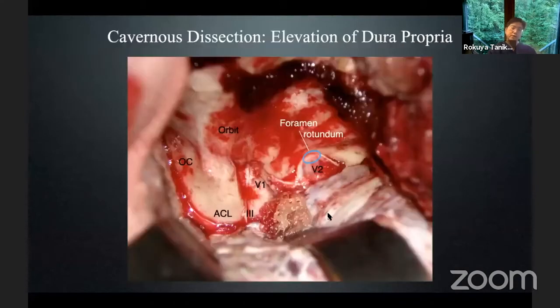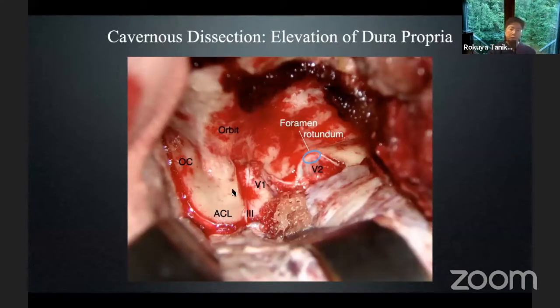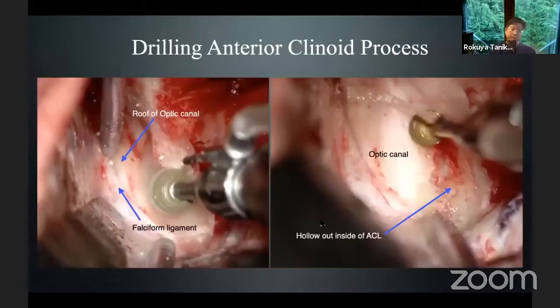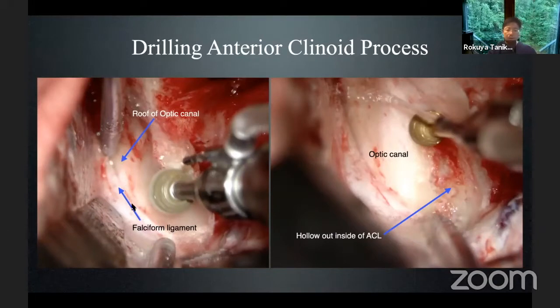This is the actual intraoperative view after elevating dura propria from the superior orbital fissure, exposing the anterior clinoid process lateral edge, V1 and V2, foramen rotundum right here, and the oculomotor nerve should be here. After anterior clinoidectomy, we can skeletonize the optic canal by skeletonizing the optic roof and anterior clinoid, making the hollow inside the anterior clinoid process.